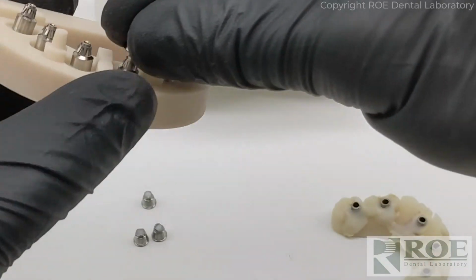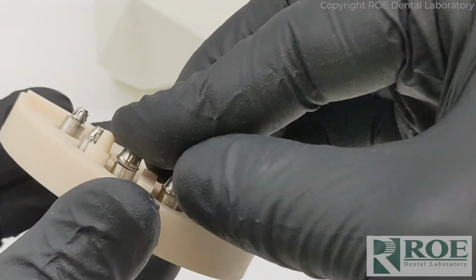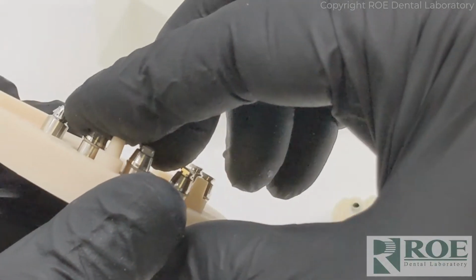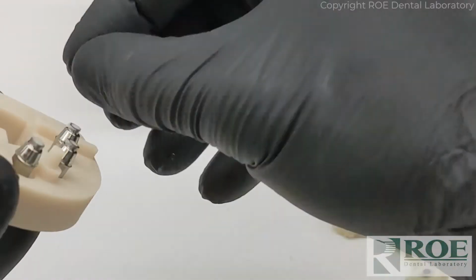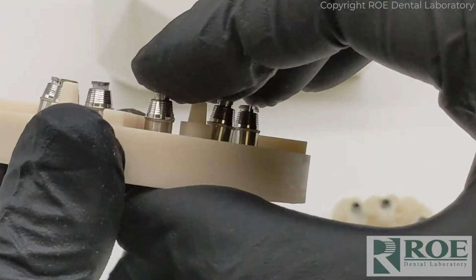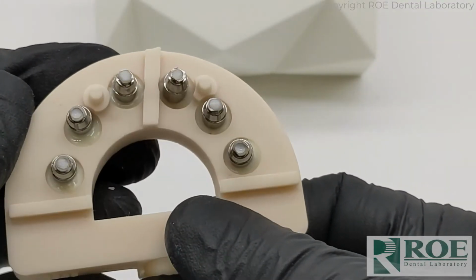Okay, now I'm going to add the rest of them to the model. They basically just clip in. You can hear them snap. You'll hear them when they snap in the mouth, when they snap out of the mouth back in the model. Okay, they're all blocked out.